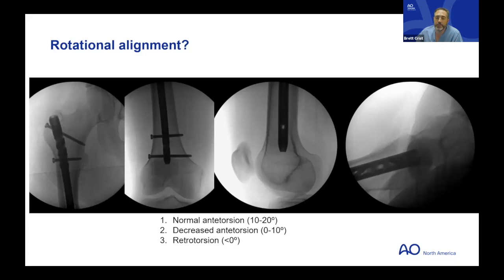All right, the important thing is that everybody kind of noticed that, or at least 60% and 78% noticed that, there's something abnormal. And so if you look, I thought they had actual retrotorsion. So even with the femur externally rotated, and you can see that in the distal segment, the axis of the femoral neck is posterior to the anatomical axis of the femur. So in my mind, that means that they are in retrotorsion.